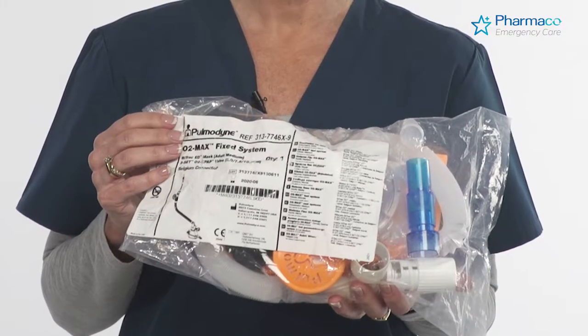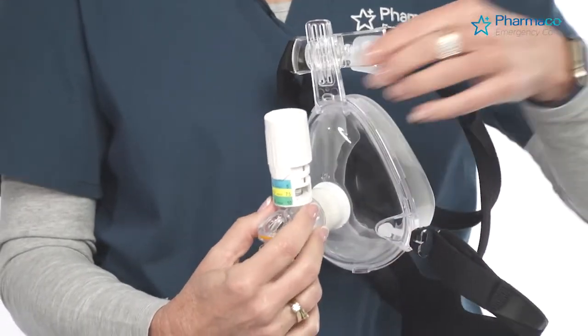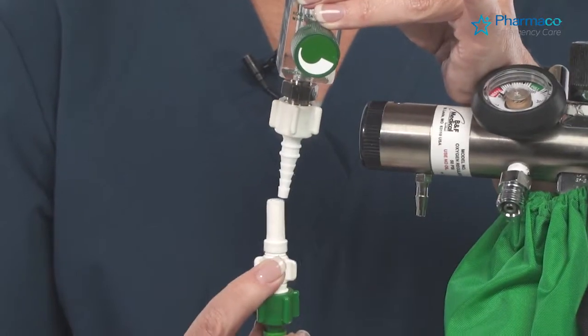Today we're going to talk about the O2 Max, and that's a CPAP device that is used in adults over 30 kilos in the pre-hospital and hospital environment for a specific set of respiratory conditions. And when would you use it? We use it as an adjunct for respiratory support for a specific number of conditions.